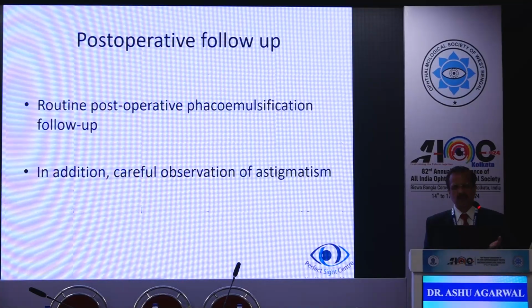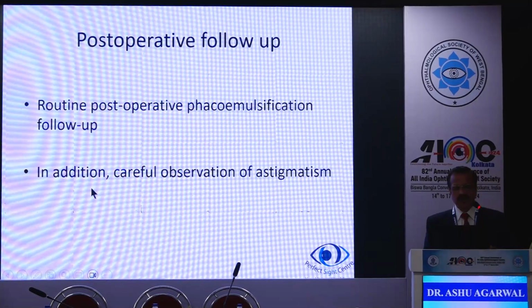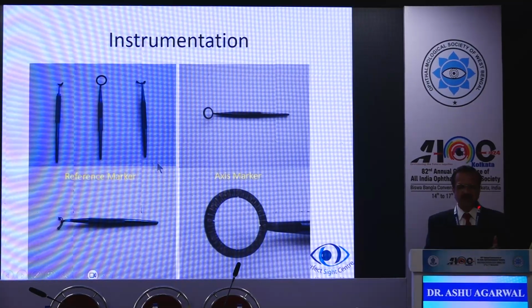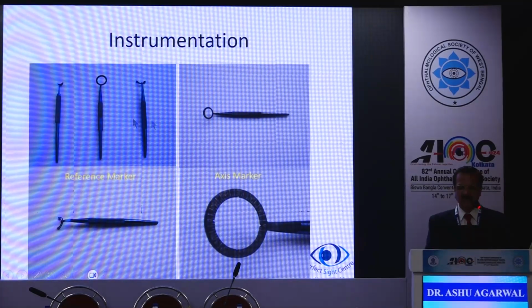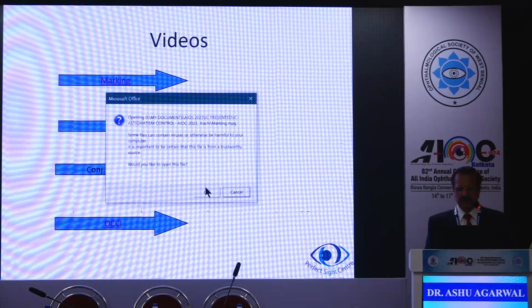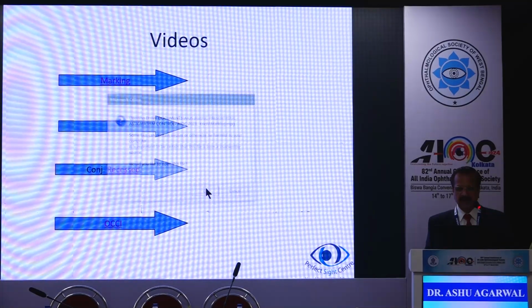Post-operative follow-up is a routine post-op phacoemulsification follow-up. In addition, careful observation of astigmatism should be done. This is the typical instrumentation, the axis marker, the reference marker. Few short video clips I'd like to show, just to highlight.